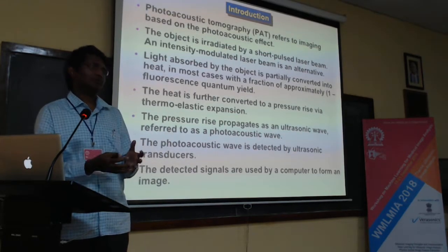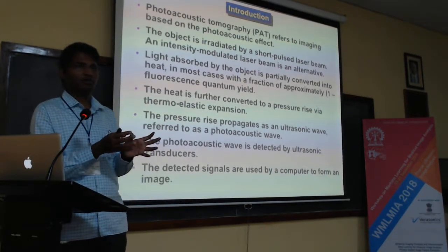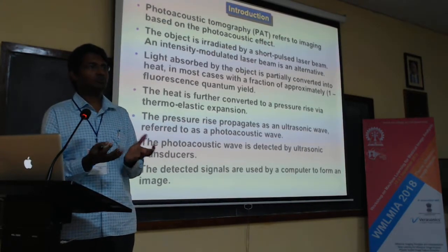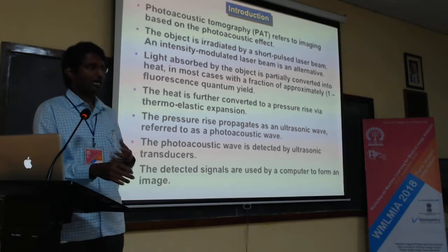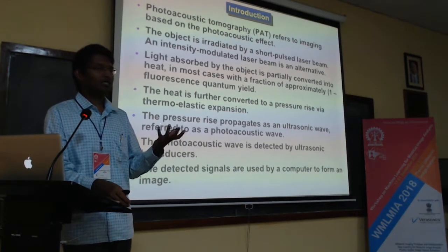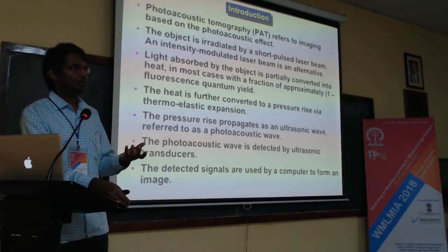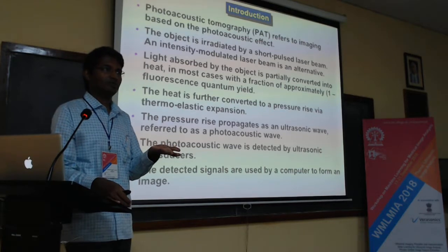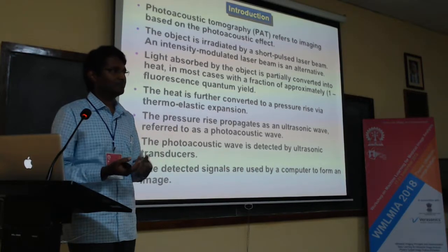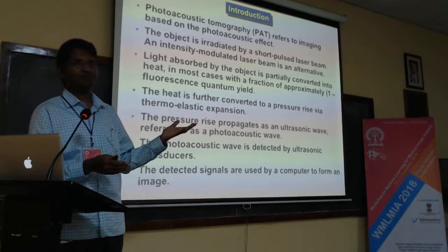We put ultrasound, or you can say acoustic, detectors, because ultrasound, as somebody already pointed out, refers to both sending and receiving. Here you are only receiving. So you put acoustic detectors all around the tissue and collect the signals at time t, and what you are interested in is, at time equal to zero, what the initial pressure is. So because of this laser irradiation, we talk about the initial pressure, which is p naught, and what you are detecting is at the boundary at time t. In a simple sense, you detect at time t, and then you want to go back in time to everywhere in the tissue.